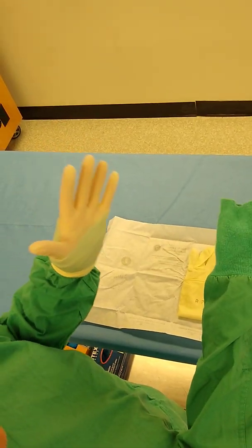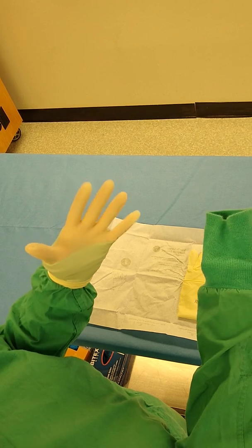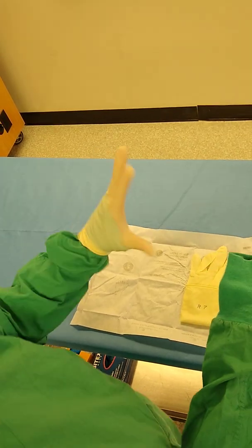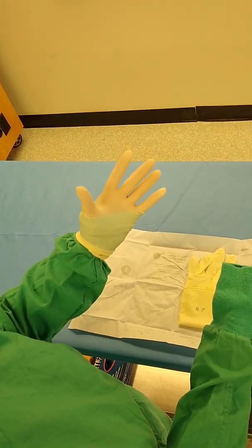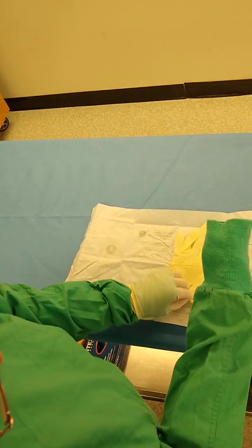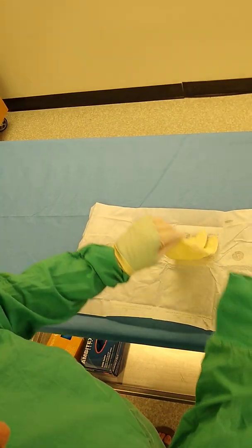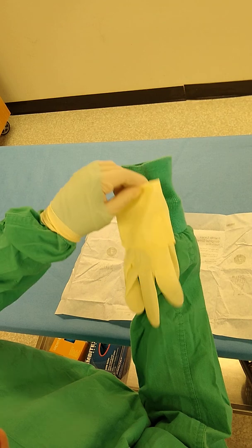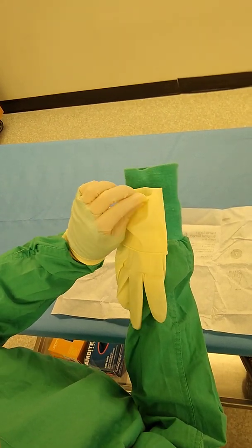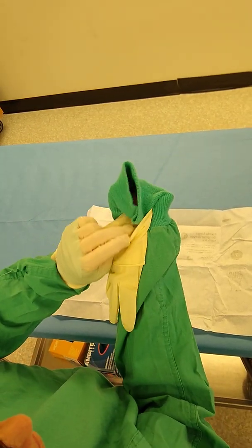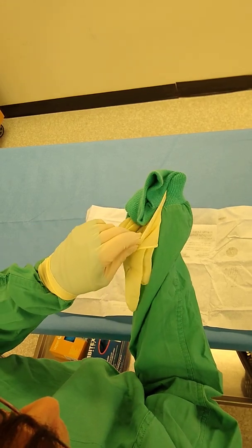Okay, if you cannot do that that easily in the beginning, you have to wait until you get your other glove on. Okay, so my hand is out. I'm not worrying about anything else at the moment - I just want to get my other glove on. So at this point I'm picking it up again: palm to palm, thumb to thumb, fingers are pointing towards me. I'm going to take my finger clamp off that front edge of my glove.